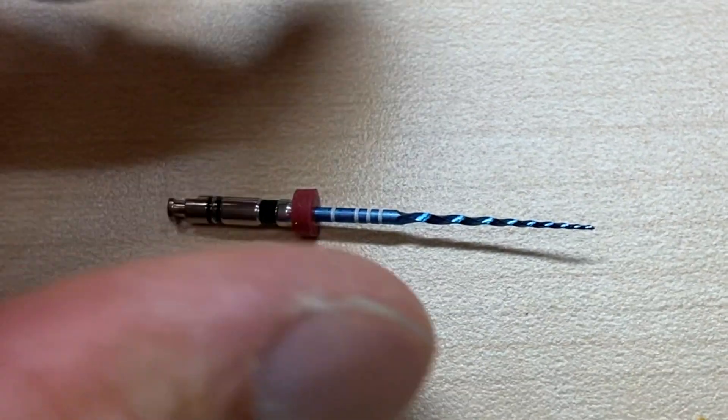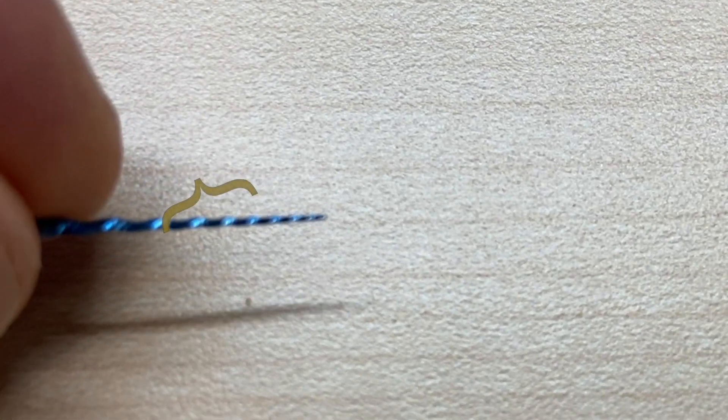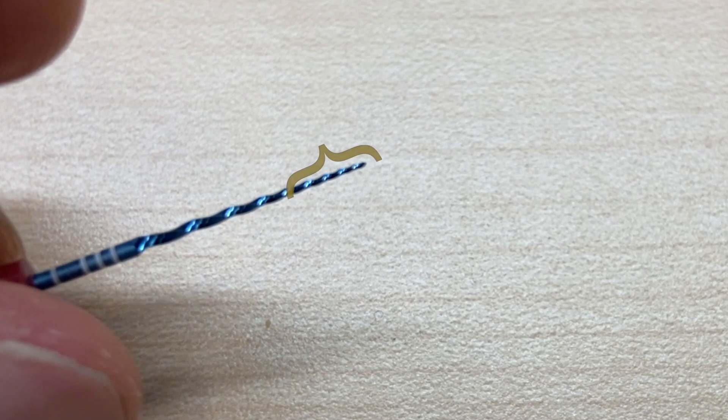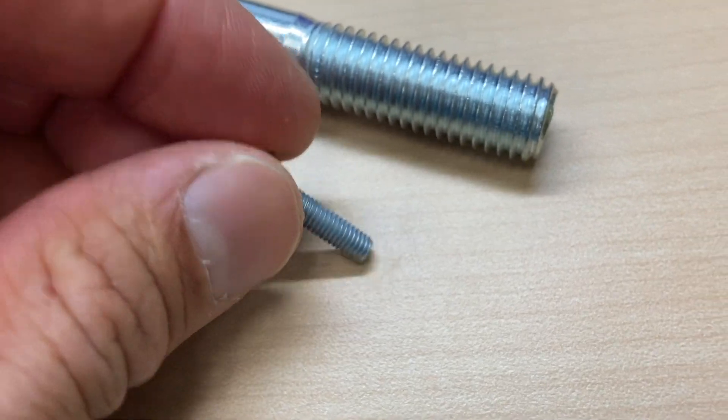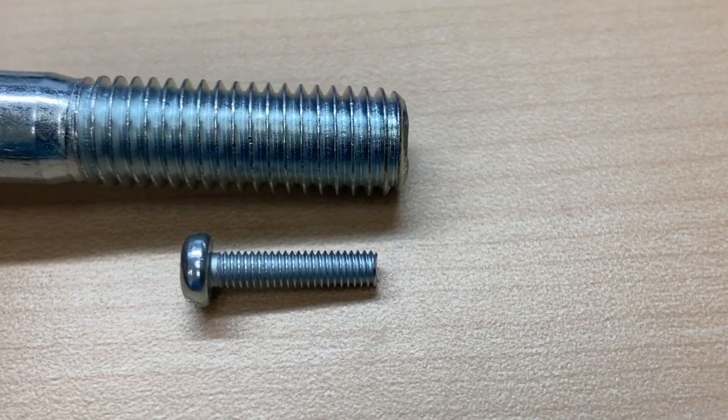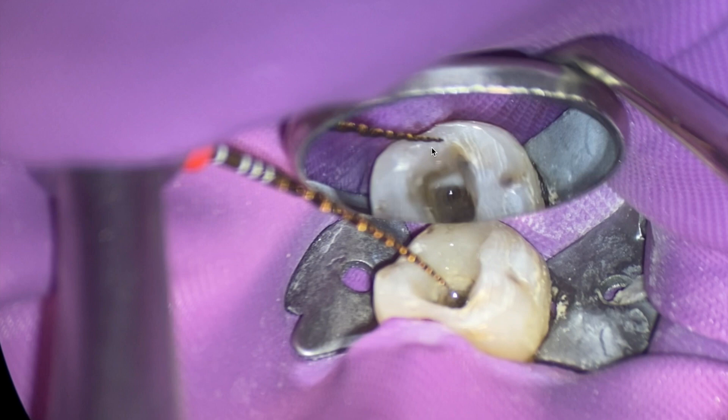When I was using Vortex Blue before, it took me a while to know the pattern because Vortex Blue — up along the flutes, the helical pattern wasn't as tight, as wound as the apical portion. The reason they do that is so the file doesn't screw in as much, just like a fine screw. So it's important to have an idea of what the file looks like. If you're doing endo, you know exactly what I'm talking about.